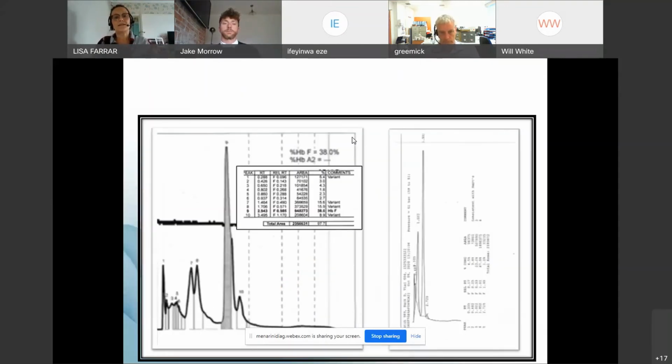By comparison, I'll show you a few slides of patients with significant disorders or positive cases. So this is an example of a baby with beta thalassemia major, where only hemoglobin F is present and hemoglobin A is completely absent in both of the scans. By looking at both of these chromatograms, you can see that the resolution for both of them is very, very good. We're getting a lot better separation on the 9210. It's clearer than on the Primus, and we're seeing all the abnormal peaks that the chromatography is picking up.